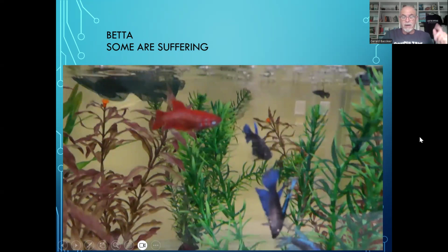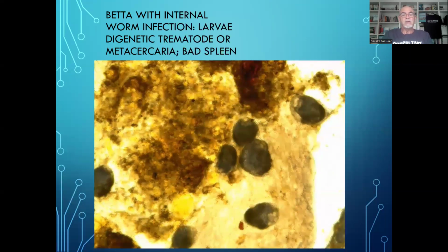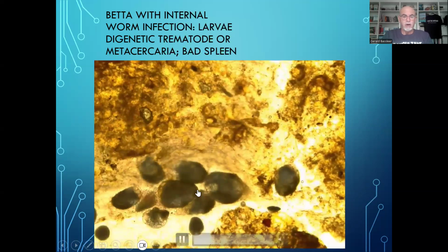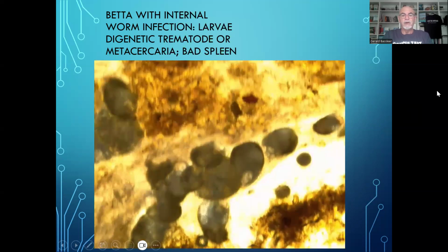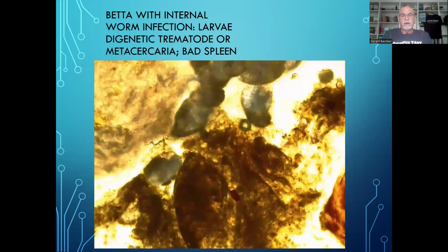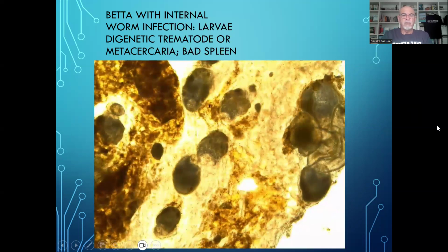That's for me as the fish doctor that comes in and takes out the very badly suffering fish, the most sick fish that are sacrificed for examination. And in this case, I show here, after dissecting the fish, that I found a lot of larvae. Here you see those dark organisms. Those are larvae of digenetic trematodes, also called Metacercaria. And they are next to the organs, next to the intestine, in the liver. And you also can see the spleen, which has many melanomacrophage centers.